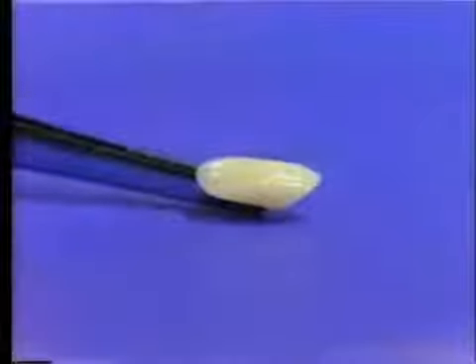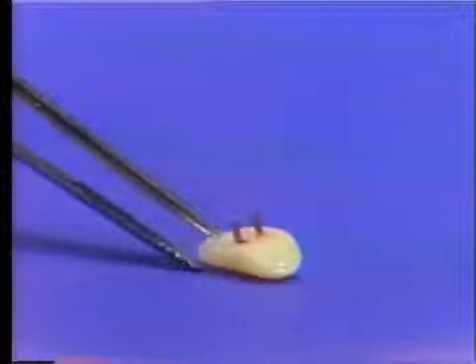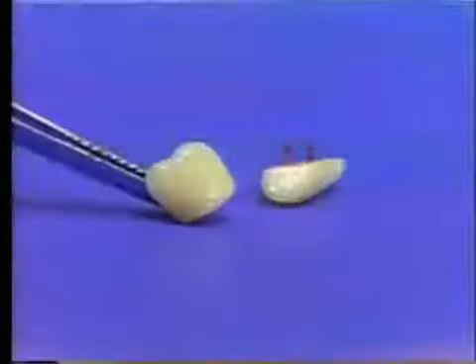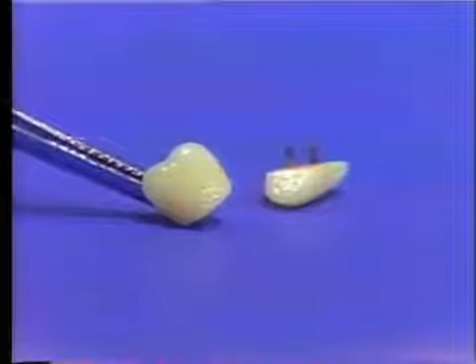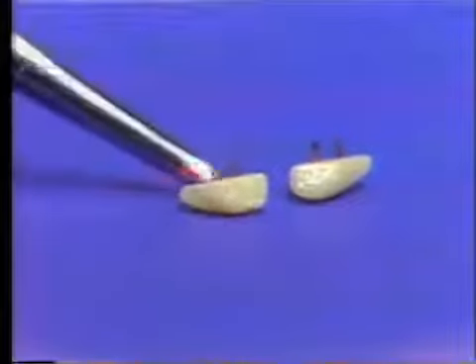Here is another long pin facing, this time for a cuspid tooth. And this again is characterized as for a cuspid on the labial surface. On the lingual surface has the two pins which are used to give attachment to the gold backing which is developed around this. Here is yet another long pin facing, this time for a molar tooth. And you can see the development of the two molar cusps. It has similarly two pins on the lingual surface for attachment to the backing.